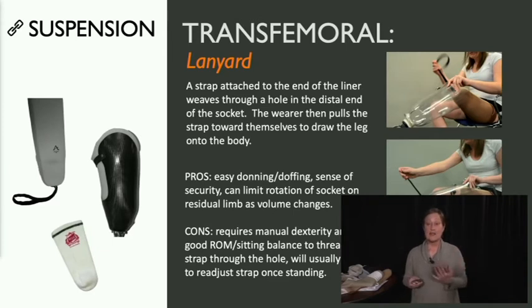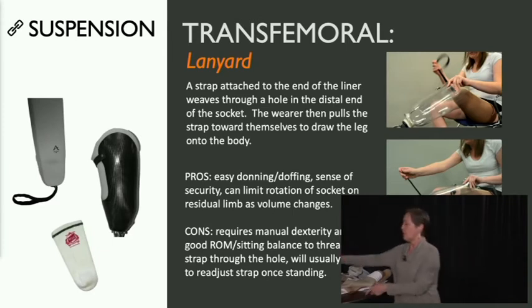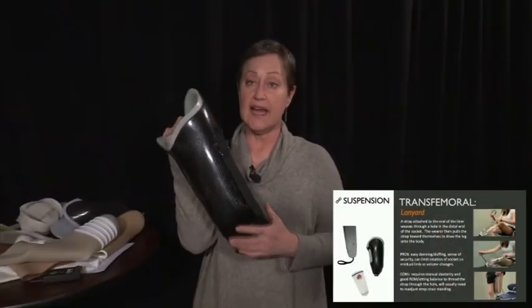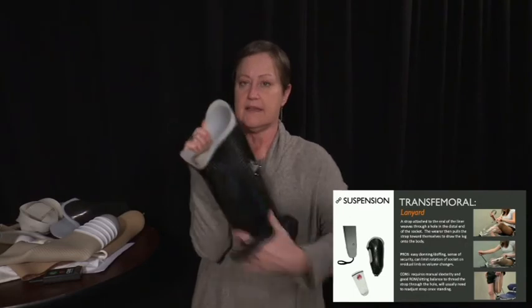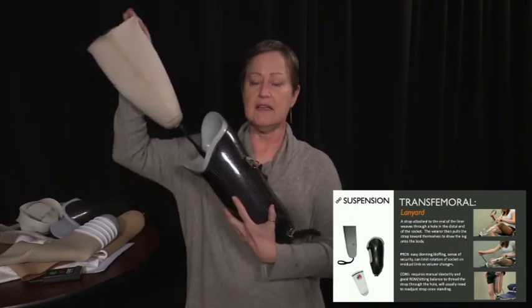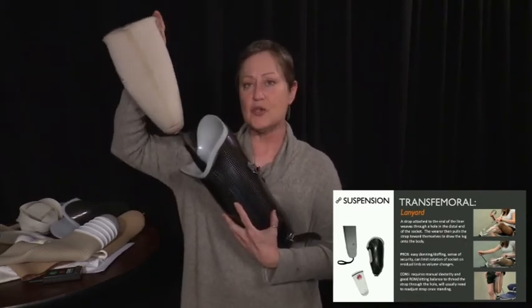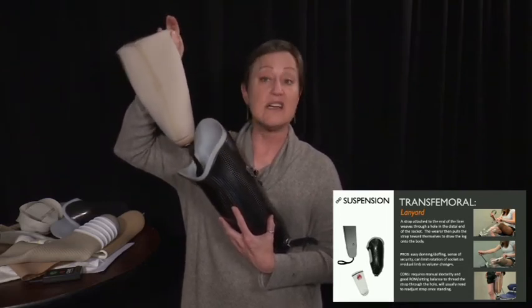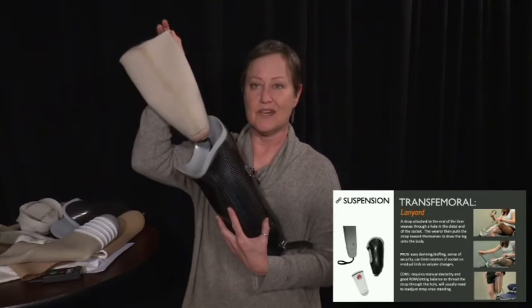Now we're moving on to the transfem level. So the classic one that a lot of you will see is the lanyard. So again, this is a locking liner with a lanyard strap on the end of it instead of the pin. That's really the biggest difference.